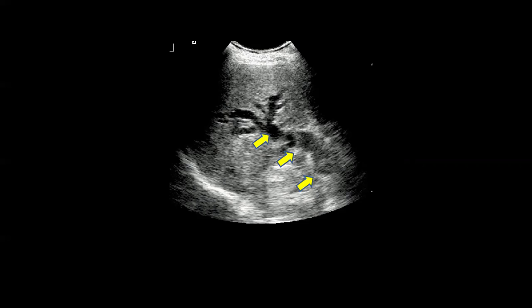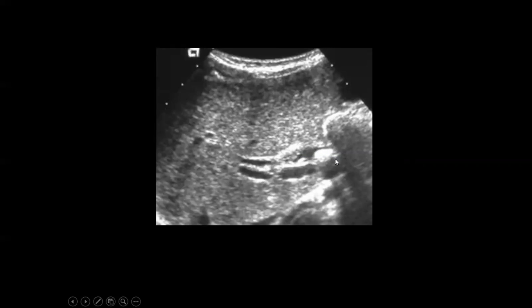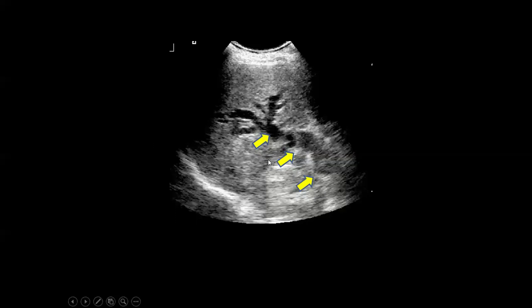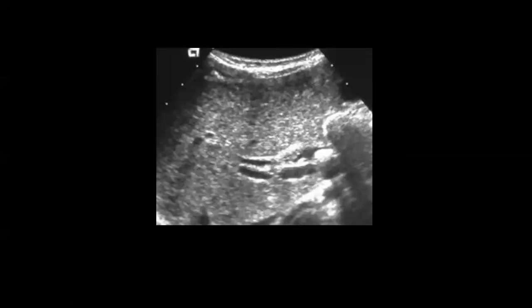Now we have to see what is the cause. Here you can see this is a stone in the mid portion of the CBD with dilated proximal intrahepatic biliary channels. So with the help of ultrasound we have assessed the cause of obstructive jaundice, which is stone in this example.